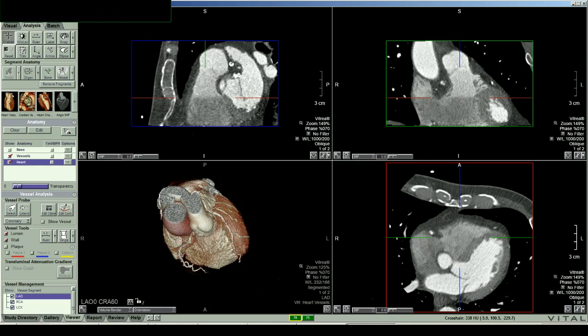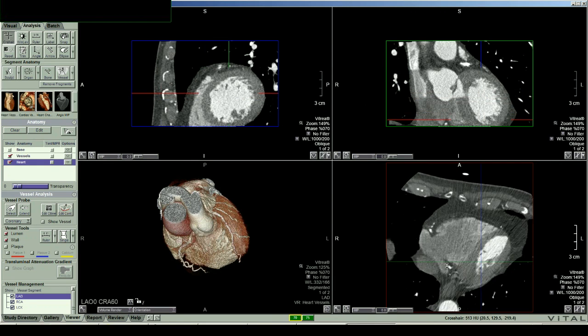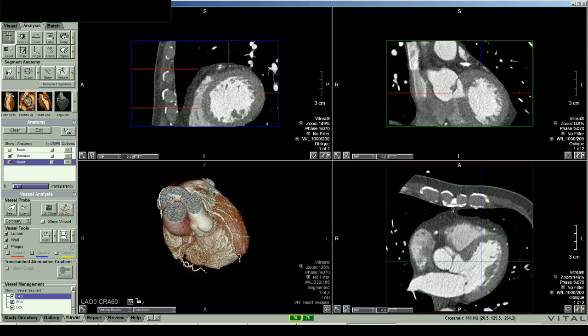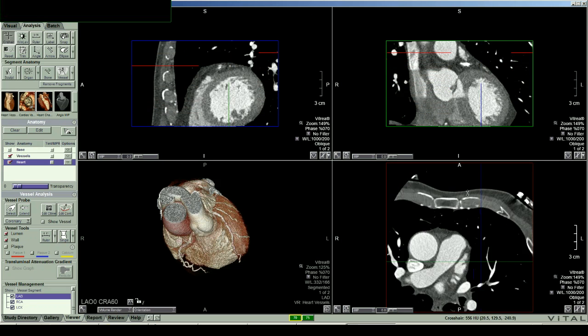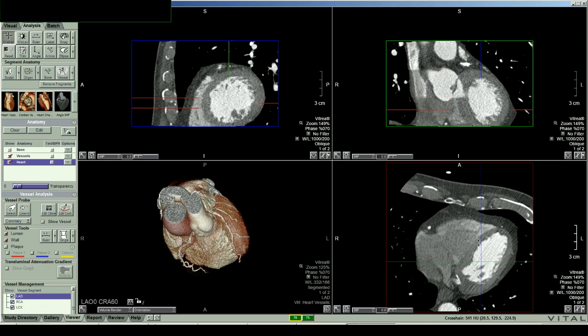And then we did an echocardiogram that looks fine too. We can look at other areas over here. It would be anterior septal and apical would be the area we're looking at. So if this patient had been someone that was having hip surgery, we'd be very concerned about that lesion being risky for drops in pressure or for changes during hip surgery. So if it's a pre-op case, we would have some concern about it.